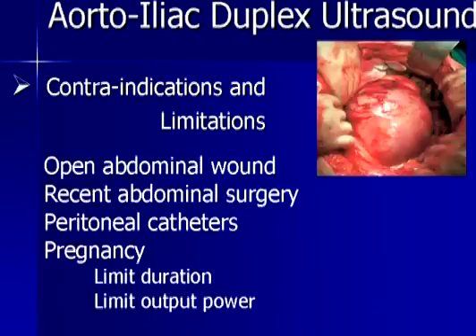There are certain relative contraindications and limitations to the study, obviously. If there is an open abdominal wound, you will not be able to place your transducer at that site, or if there's recent abdominal surgery, the patient may not be able to cooperate fully and do all the things you need them to do in terms of positioning during the course of the examination.